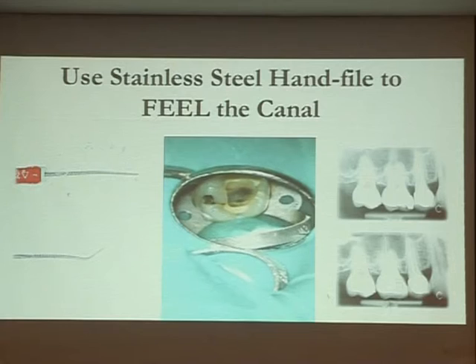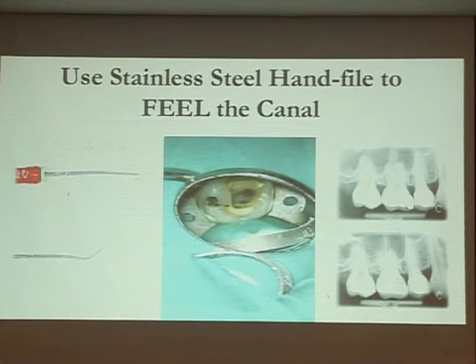There's a hidden curvature inside your canal. So if you know that, whether you're using rotary or hand files, you need to be more careful. I didn't decurve the file, I just went in with a straight file and took it out, and it's bent. I will straighten it, do it once more, and the same curvature comes out, which means there's a curvature inside your canal. So you need to be careful.